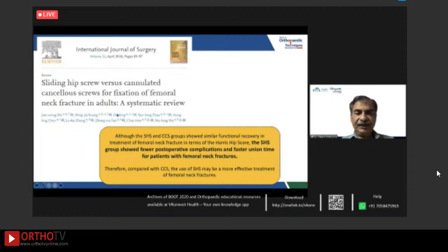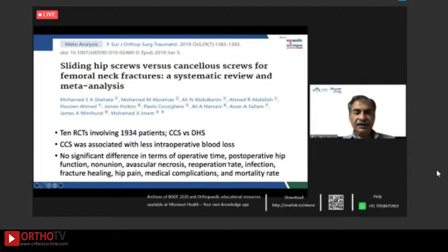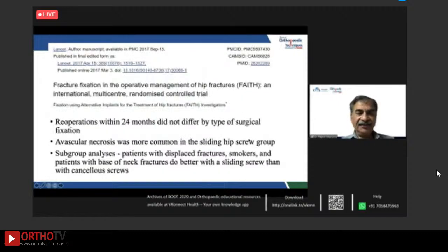Now, a lot of systematic reviews have been done. This one said that there is actually lesser complications with sliding hip screw and faster union time, whereas the other systematic review and meta-analysis said there was no difference except that there was a lower intraoperative blood loss with the cancellous screws. In this particular paper, the FAITH trial, they recommended that patients with displaced fractures, smokers, and the patients with base of neck fractures do better with a sliding hip screw. All other groups, they are comparable.